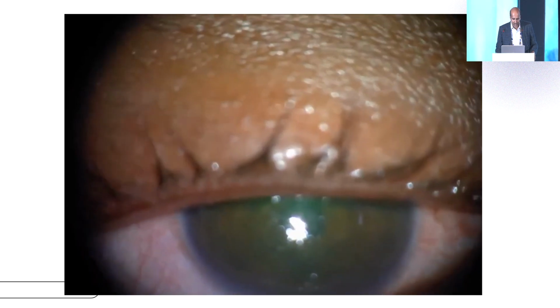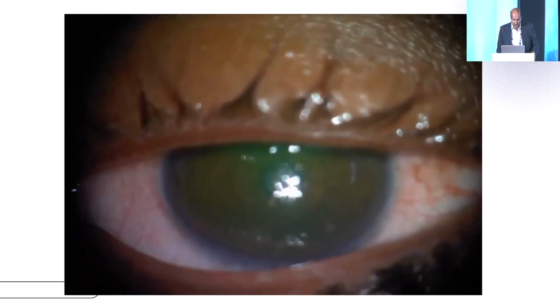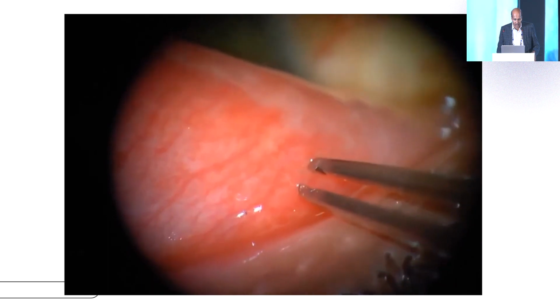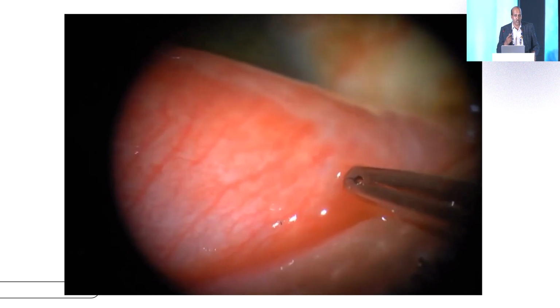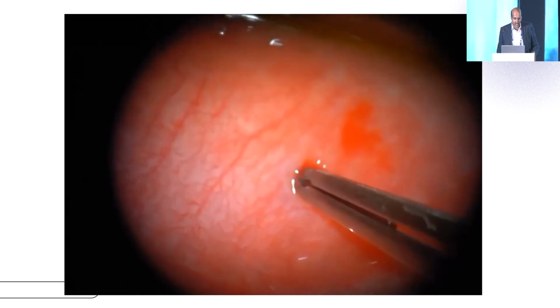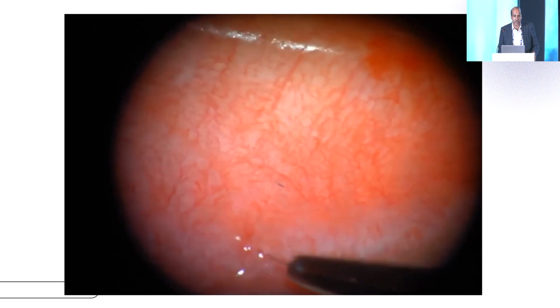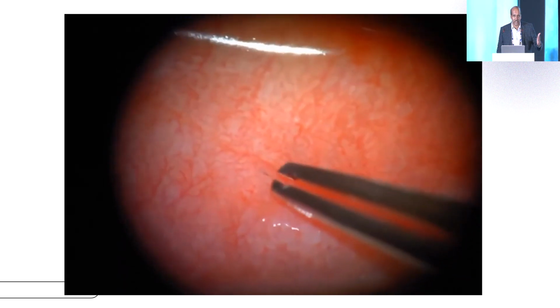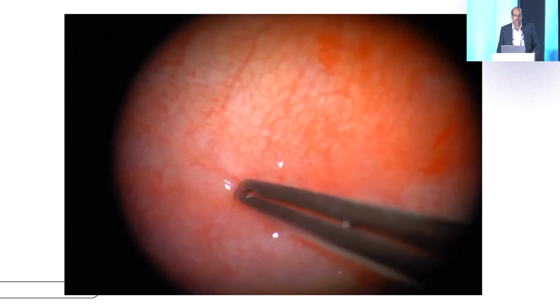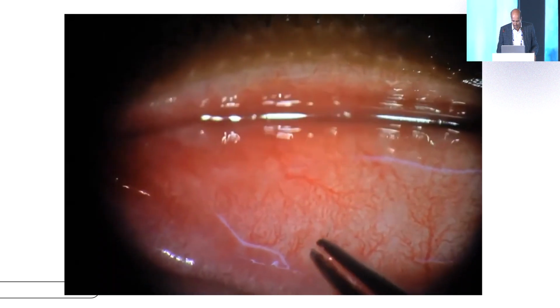So the patient usually comes with just chemosis and corneal edema and fluorescein stain positive. This is where you have to go to the OR, especially for the upper lid, where you have to pick these. This is post-steroid treatment. Once the chemosis comes down, you can pick these small pinhead-like lesions that appear dark on the surface, but are quite deep inside the conjunctiva. This requires multiple sittings. This is just a single video, but it was over a period of 6 to 7 days. Anything on the inferior fornix can always be done under topical anesthesia on the slit lamp.